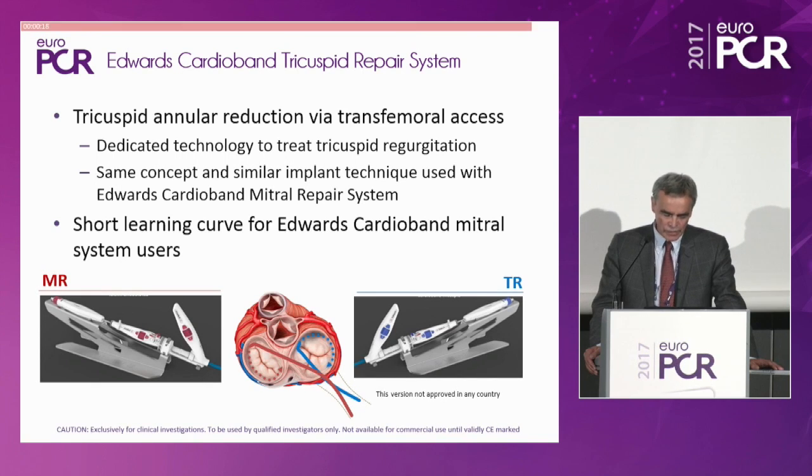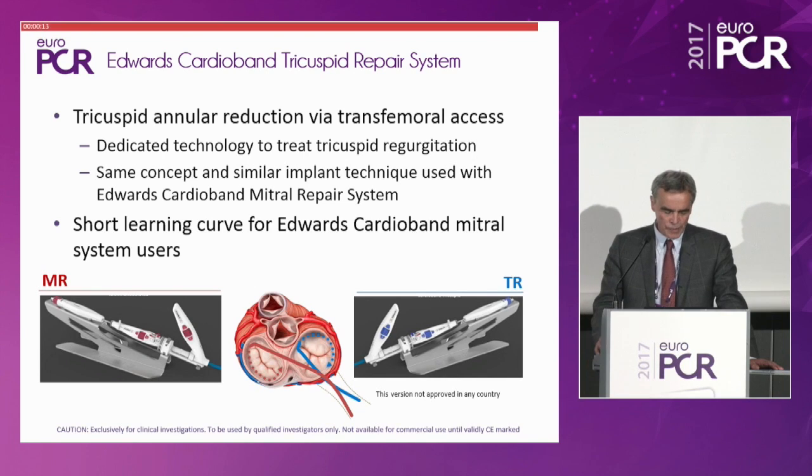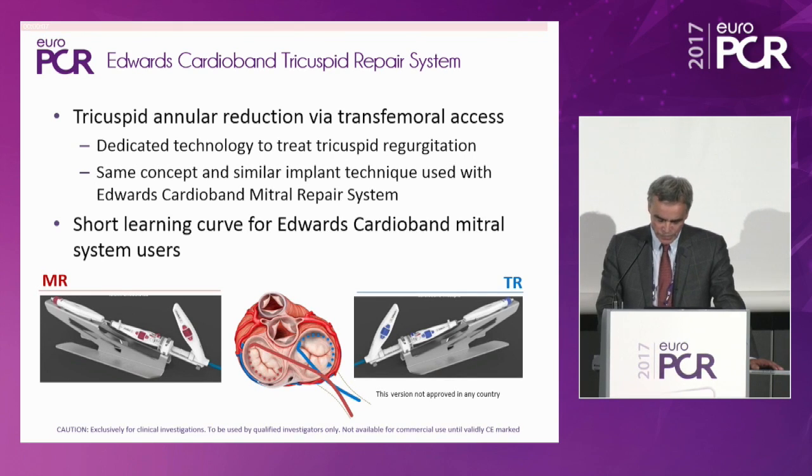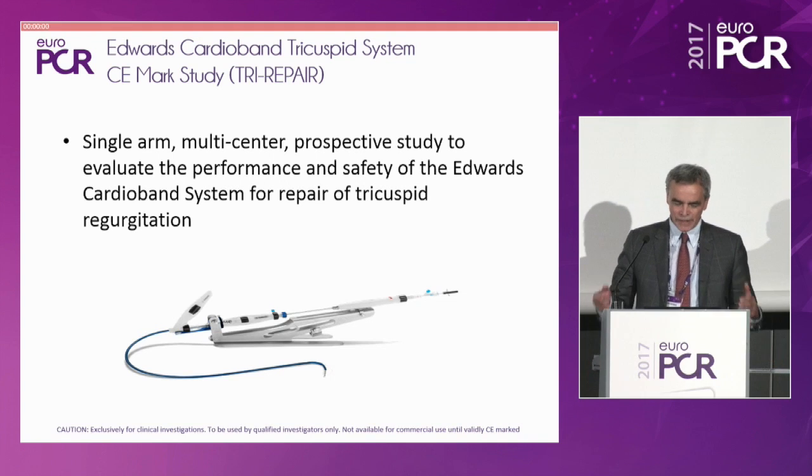which is very helpful if you start on the mitral side, if you have clip experience. Now here, you simply continue with the experience on the mitral side. The only precautions were very nicely pointed out. You have to take care of the right coronary artery, which is very crucial, and of course of the AV node. So it's my real pleasure to summarize the first results of an ongoing study.